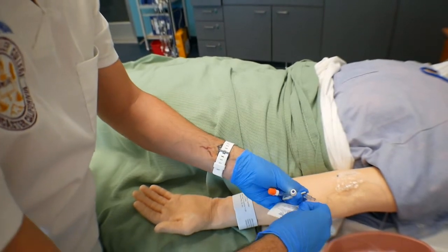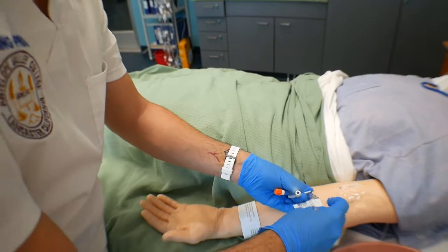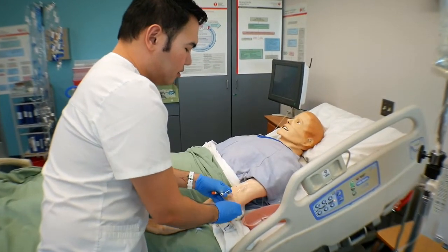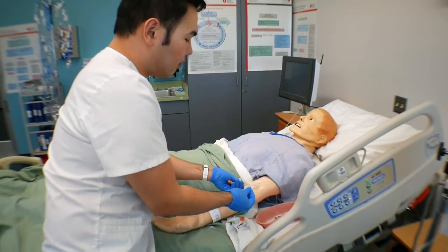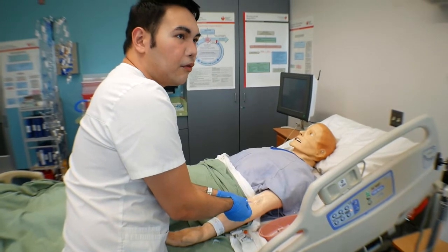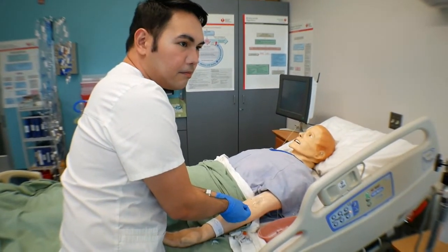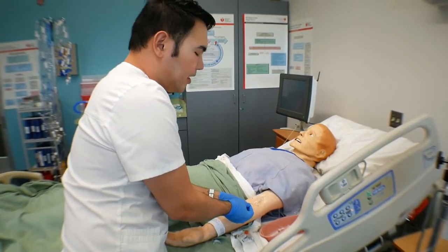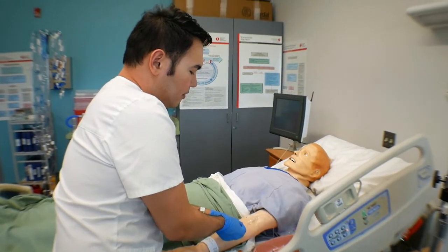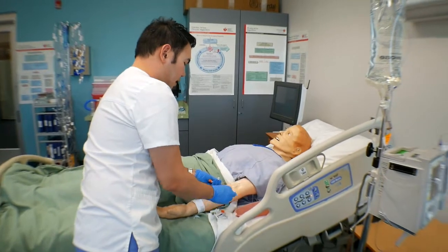So now we're ready to put in the primary tubing that we prepared. Before everything else, you also make sure you swab the Y side again. So just always swab before you infuse. Swab before you put the tubing on the patient's IV Y side. So 15 seconds.